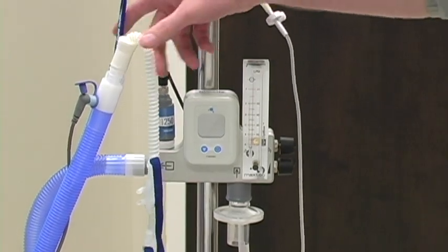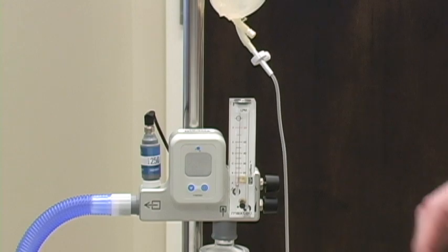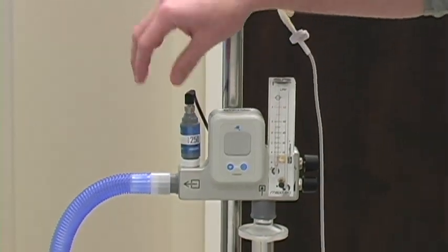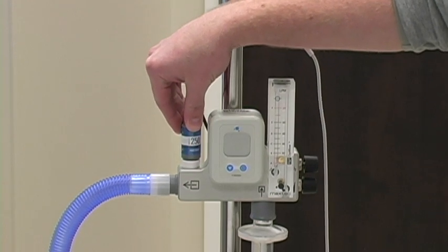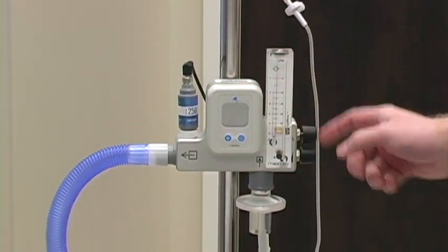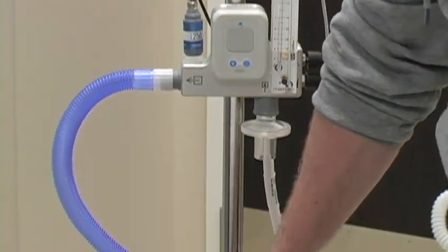This is your oxygen analyzer. So let's move this right here out of the way. This is the oxygen analyzer here. The only thing for nursing to know with this is if this falls out, there's a big hole there. It needs to be just pushed back in, and it's just friction fit into there. Once you set the flow and the appropriate oxygen concentration with your dials, the flow is sent through this big tubing down to our heater.